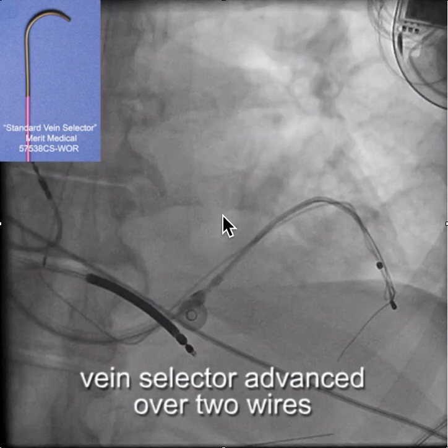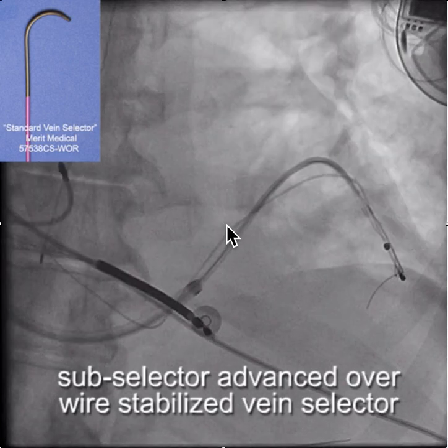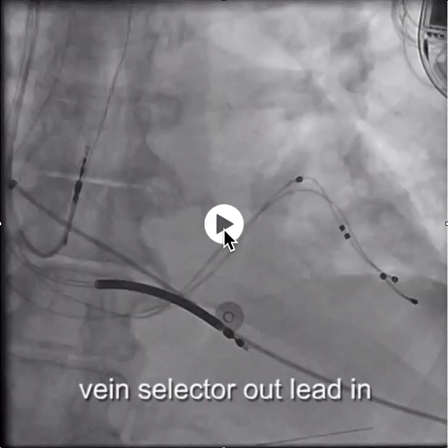From there, we are able to advance the subselector over the vein selector. The vein selector is stabilized with the wires and creates a rail over which you can advance the subselector. Now we have the subselector deep in the branch, and then we just remove the vein selector and put the lead in.